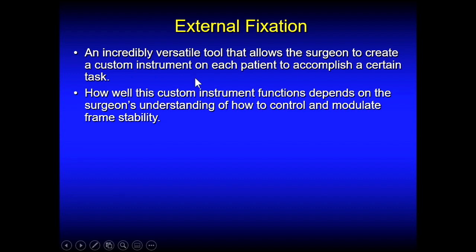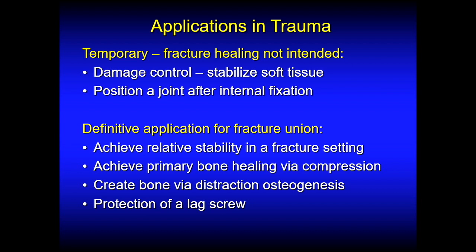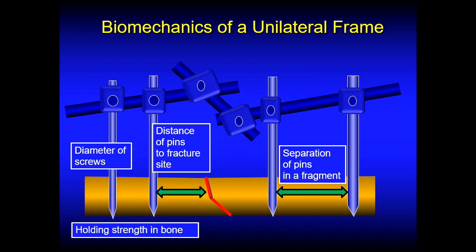External fixation is an incredibly useful tool that allows a surgeon to create a custom instrument for each patient, for each individual application, and to do a certain task. How well this custom instrument works depends on how it's used and how well the surgeon understands how it's used. It's sort of like a musical instrument. You learn about it, you can use it in all sorts of different ways. Applications in trauma: temporary for fracture healing; temporary where fracture healing is not intended, as a soft tissue instrument for damage control or positioning a joint after internal fixation; and definitive fixation for fracture union. Relative stability, even absolute stability, can be achieved with external fixation.